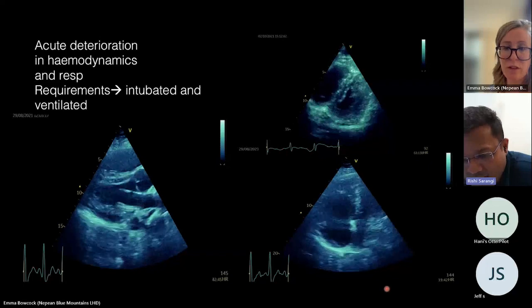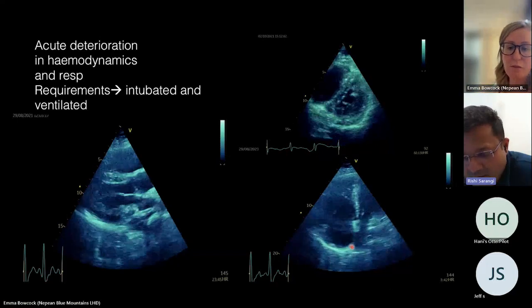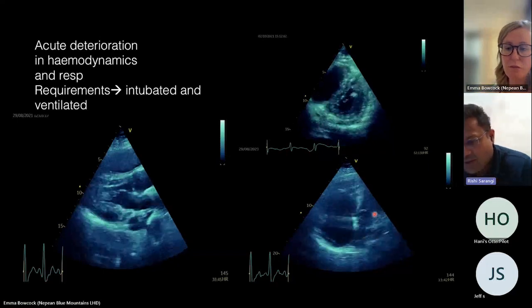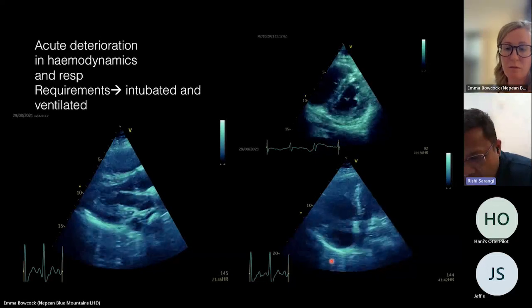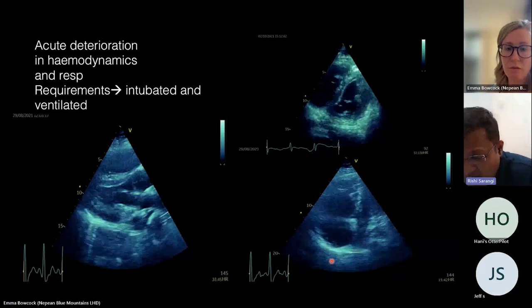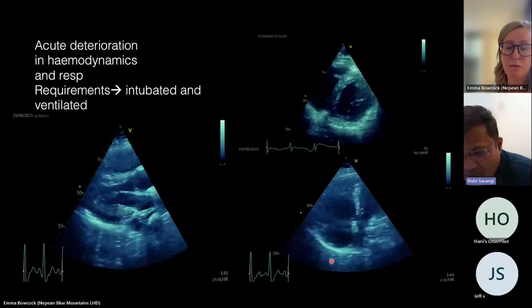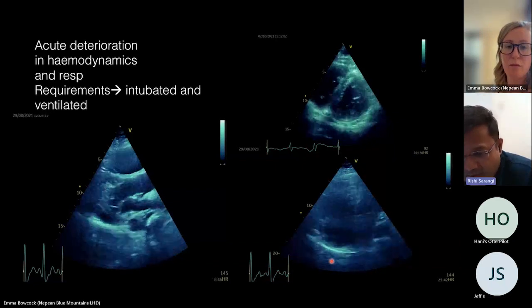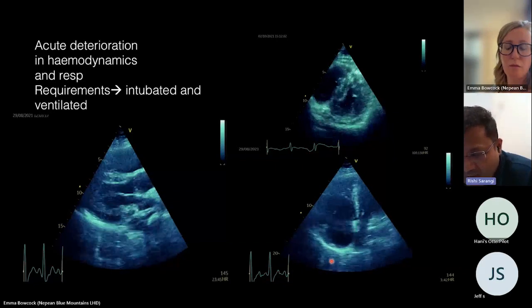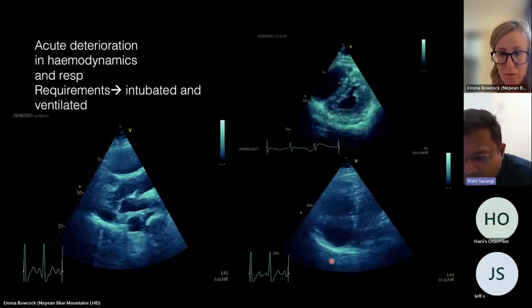In the apical four chamber view, again the RV is more than the size of the left ventricle with a large right atrium as well. The TAPSE, there is a bit of longitudinal movement, but that is more than the lateral inward movement and the apical movement. But even the TAPSE seems to be reduced. The excursion seems to be visually reduced, but needs to be confirmed.